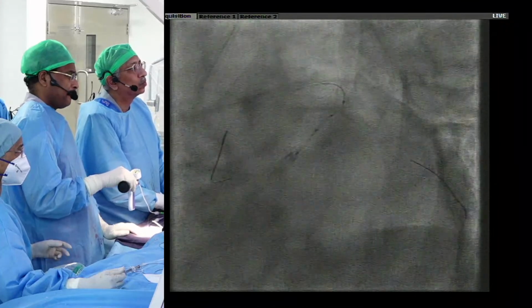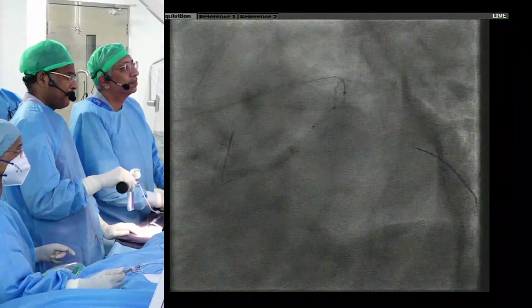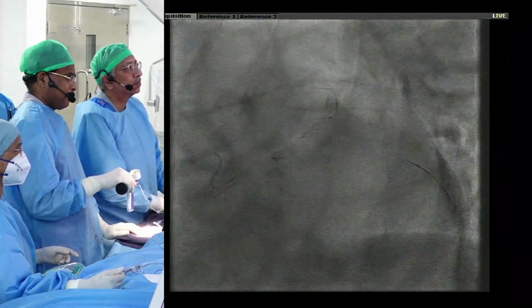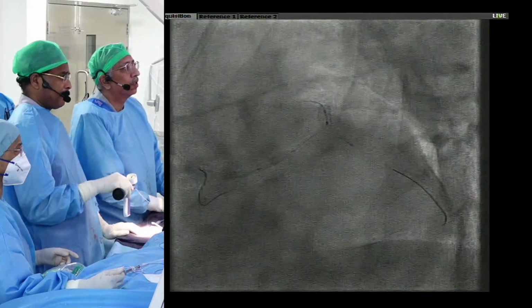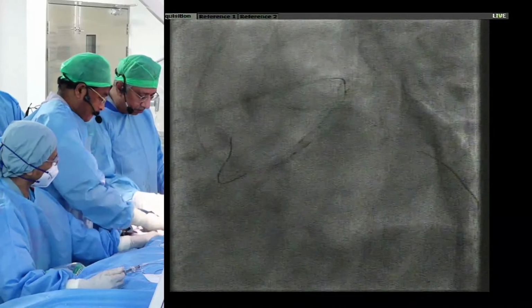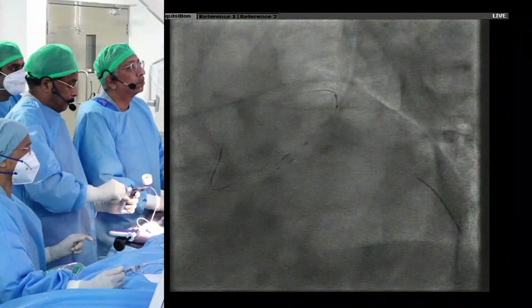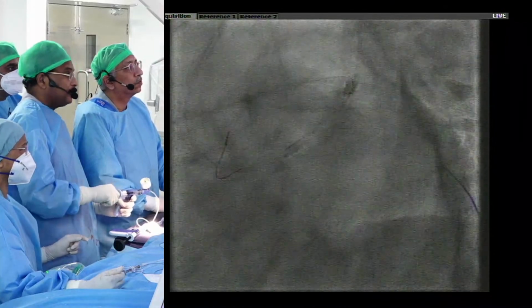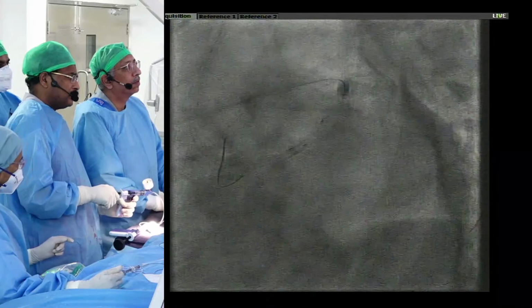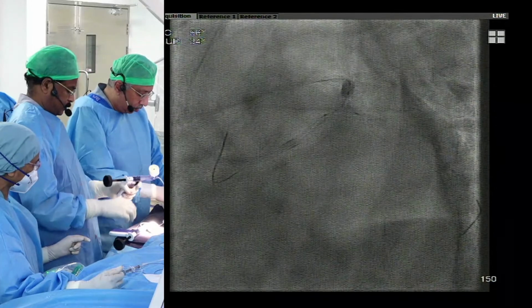So, while we've got 2 minutes, the ACS imaging? That first case, you've purchased the OCT catheter. Can you dilate the LAD? It's an ACS. It's interesting, I don't know why not to embrace imaging. I'm on the camp of image everybody, and the patients that I don't image are when there is a mechanical problem.